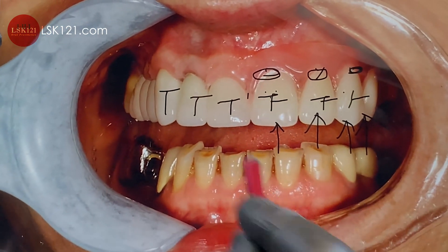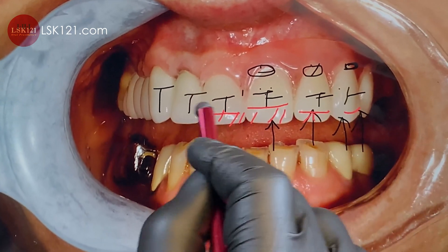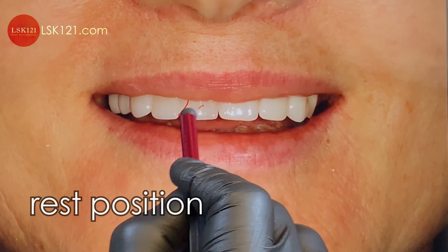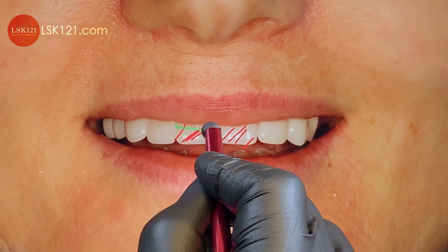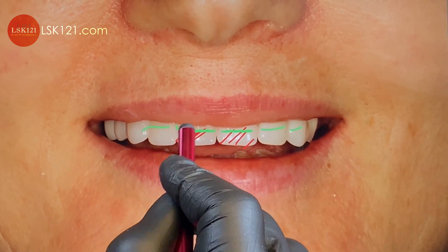We check the incisal edge — how much we increased it. This is the guidance. The bottom line is the rest position compared to before: before, they just needed a little bit of tooth showing, so we added a little bit more with the temporary.